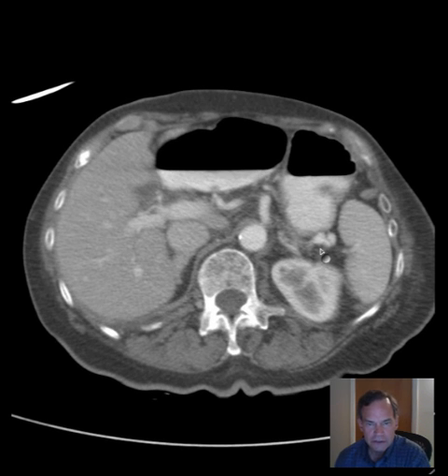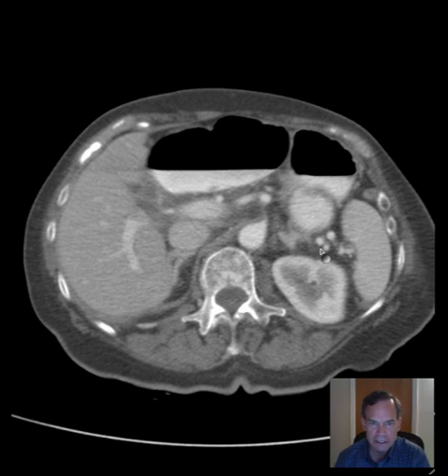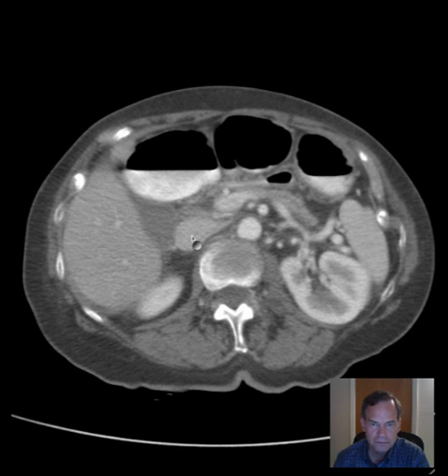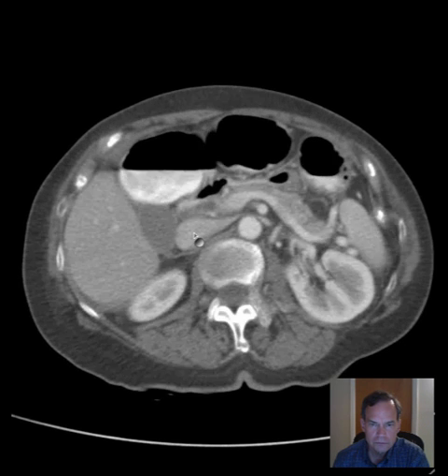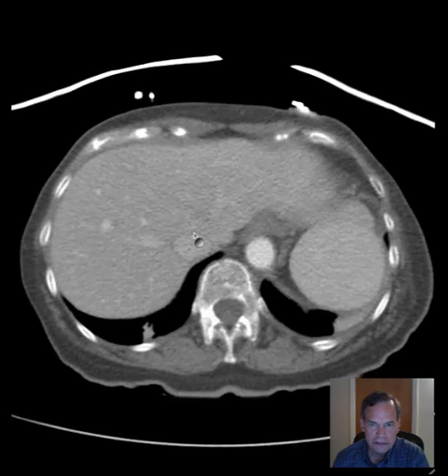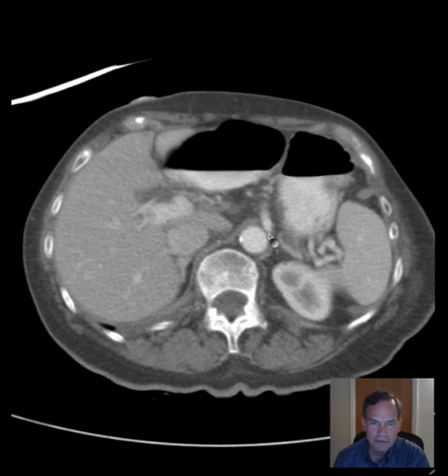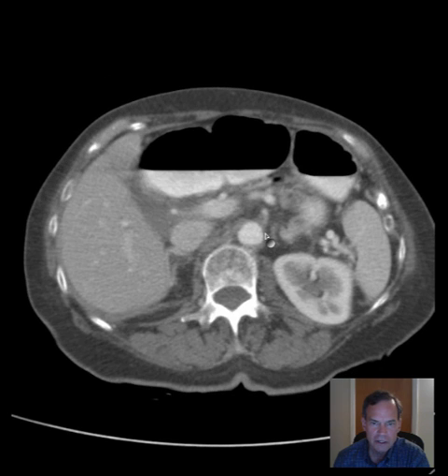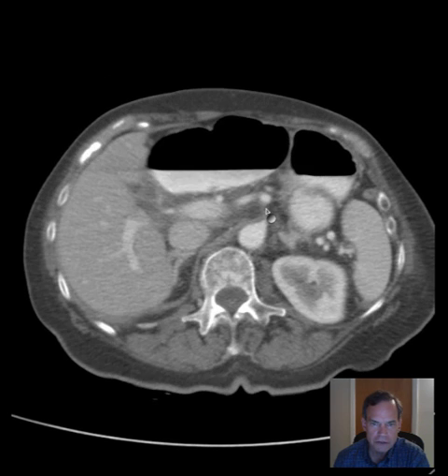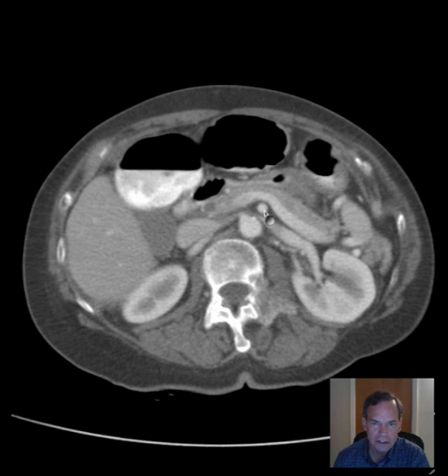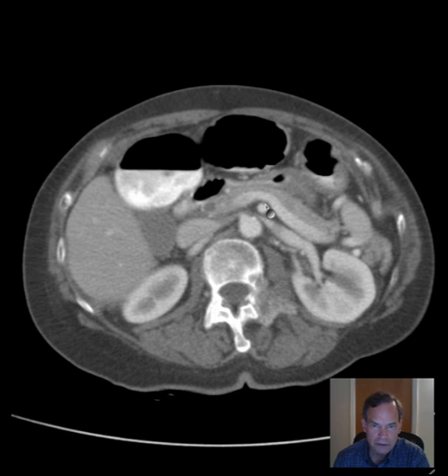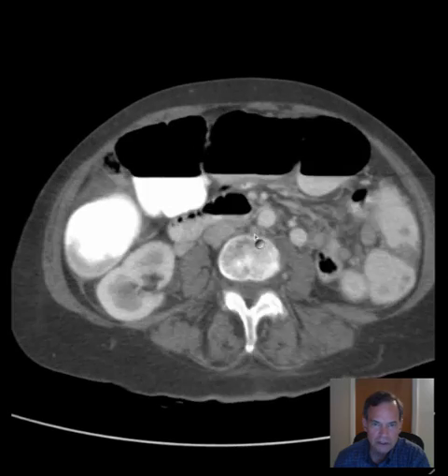The lung bases have some mild plate atelectasis. Here's the IVC. Starting from the top of the aorta, here's the abdominal aorta — first you have the celiac artery coming off, after which you have the superior mesenteric artery, the SMA, coursing right under the splenic vein. The abdominal aorta appears normal in caliber.